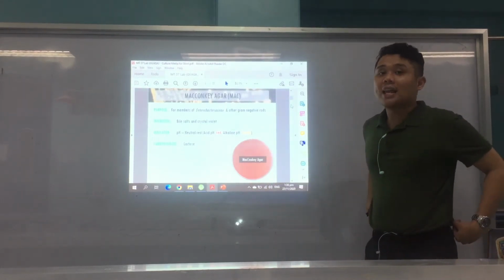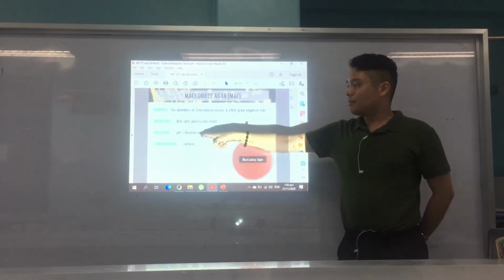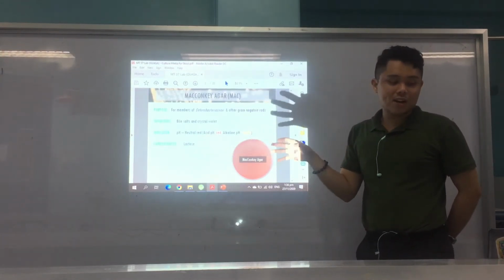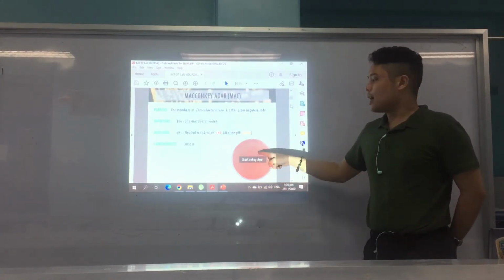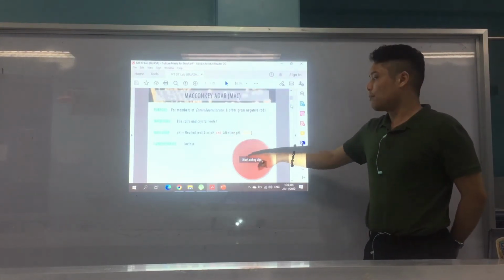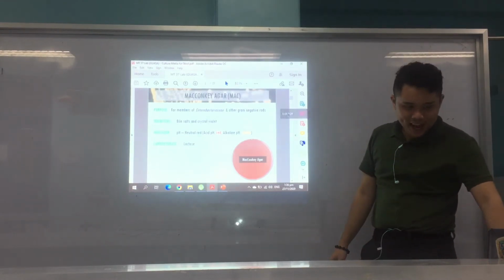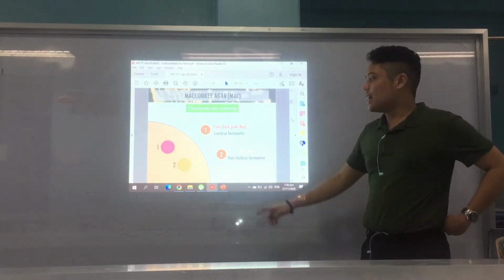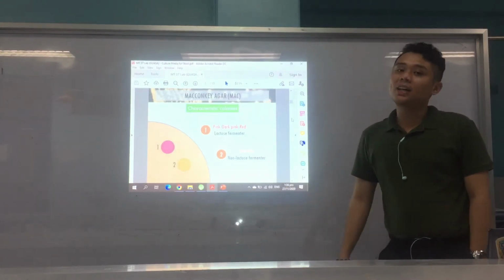and the carbohydrate unsa? Lactose. Okay? Please take note. Now, again, muna siyang pink colony because again, if your organism is a lactose fermenter, i-break down niya ang lactose to acids, di ba? The results of fermentation of sugars are your acids. So therefore, because of the acidic pH, mo-red siya, and it will now appear as pink colonies dire. Recall? Alright? So again, ang hirap pag hindi PowerPoint. So again, characteristic colonies or unsa tong lantawon sa MacConkey agar: kung pink, dark pink, or red, these are your lactose fermenters, and kung colorless, non-lactose fermenters.